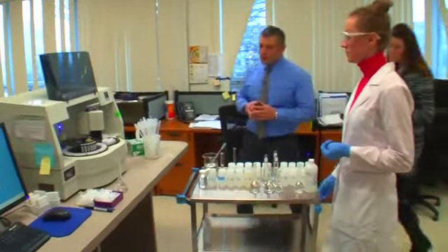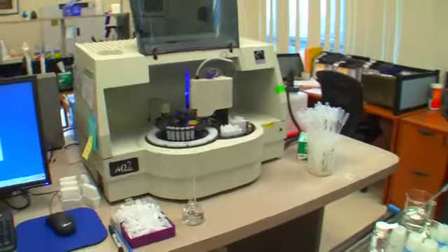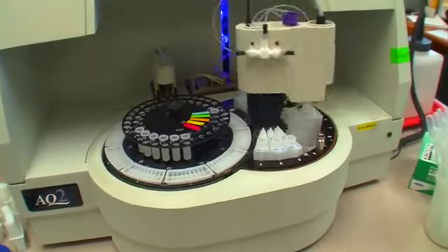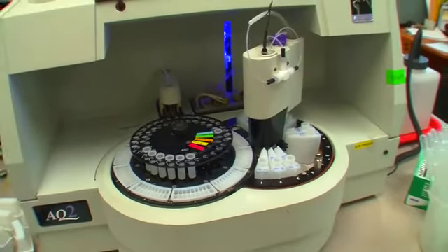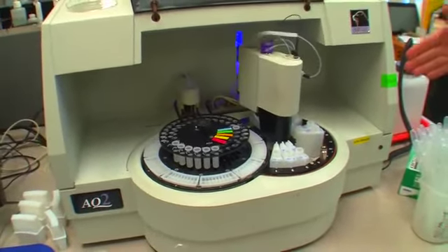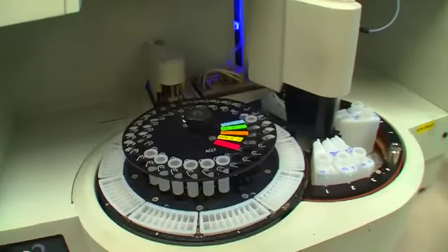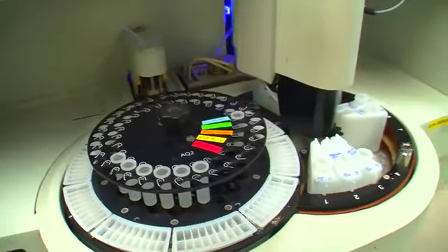Another portion of the laboratory is our automated chemistry section. Amita, our water quality analyst, has just set up a run here for phosphates, ammonia, nitrogen, nitrates, nitrites. So what happens here is this automated arm can go around and sip and sample bits of reagents and water, and we're looking for a color reaction to determine the concentration of any of these constituents within any water sample.